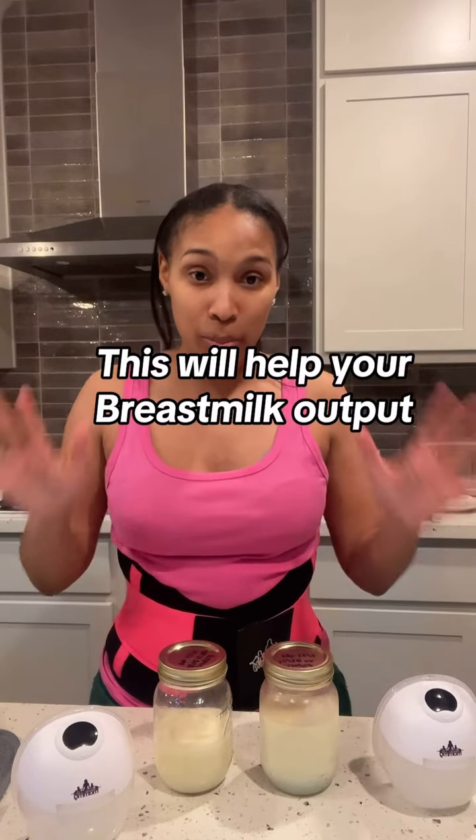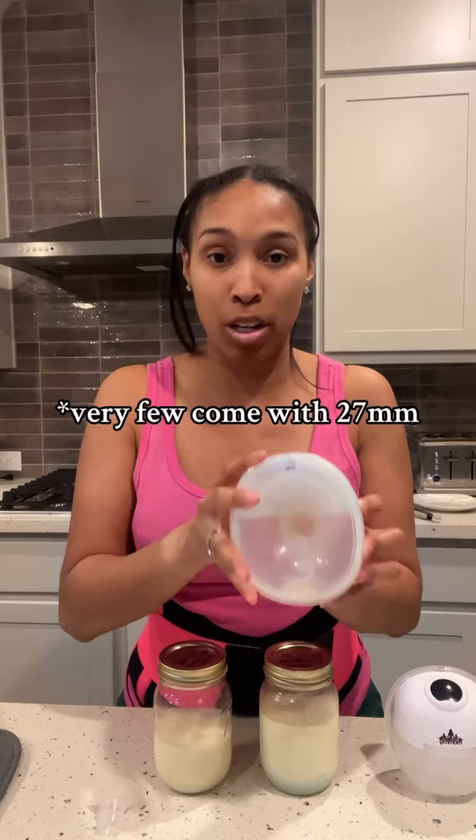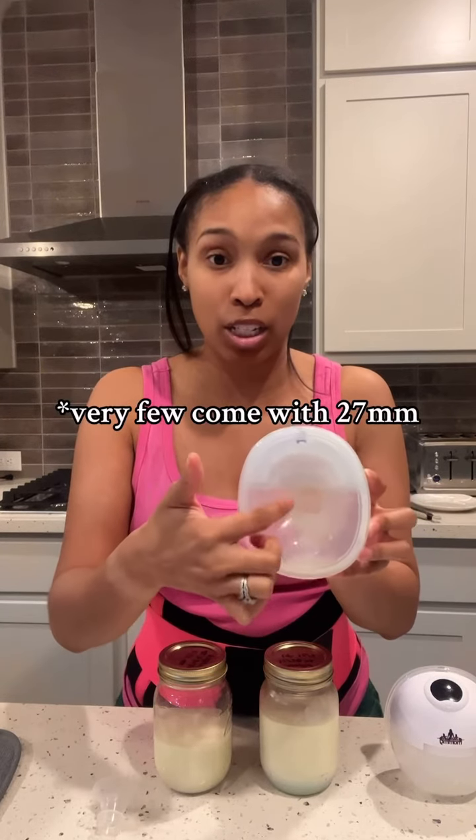Doing this one thing is going to make or break your pumping experience. I'm using the Muscle Up Mommy J35s — here's my pump supply from my first session and my second session of the day. I want to show you what will change your output: these flange inserts. Whether you're using Muscle Up Mommy J35 or any pump, it's going to come with a standard 24 millimeter flange.